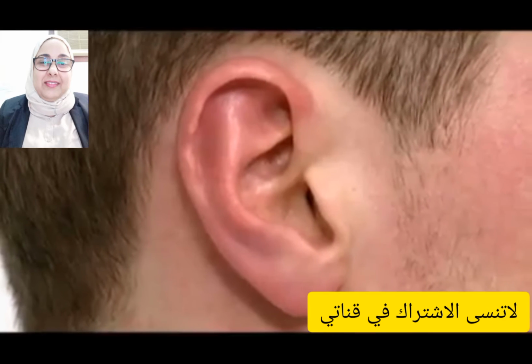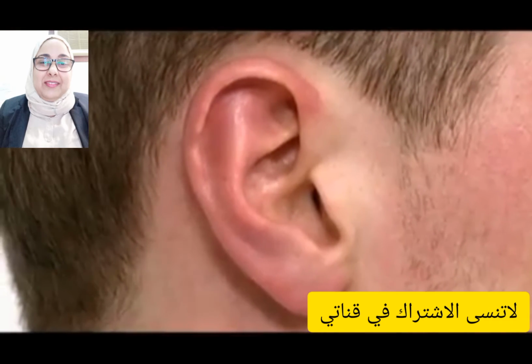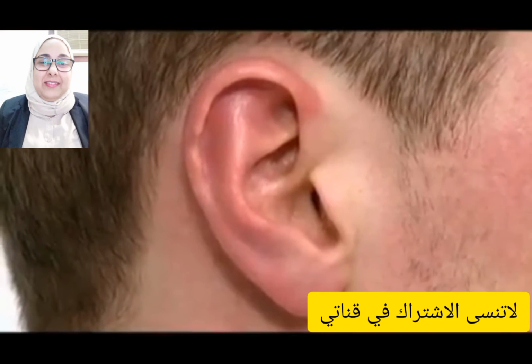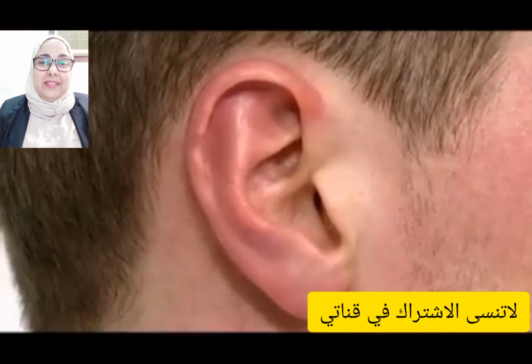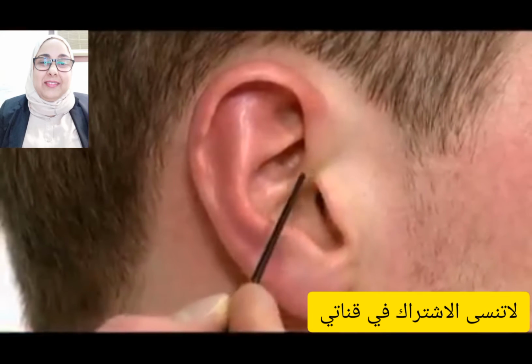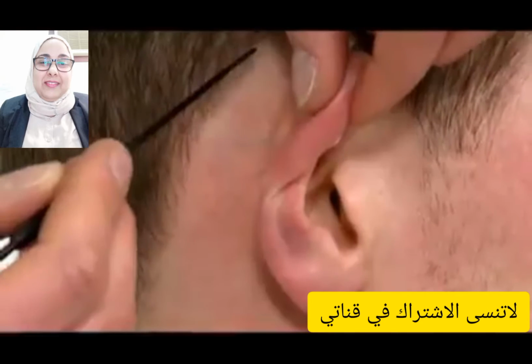First, inspect the external ear, using the light of the otoscope to help. Look at the colour of the skin and the shape of the pinna. Look for other abnormalities such as tophi and congenital defects, and remember to check for scars. Common surgical scars include the endaural scar between the root of the helix and the tragus, and the post-auricular scar behind the pinna.